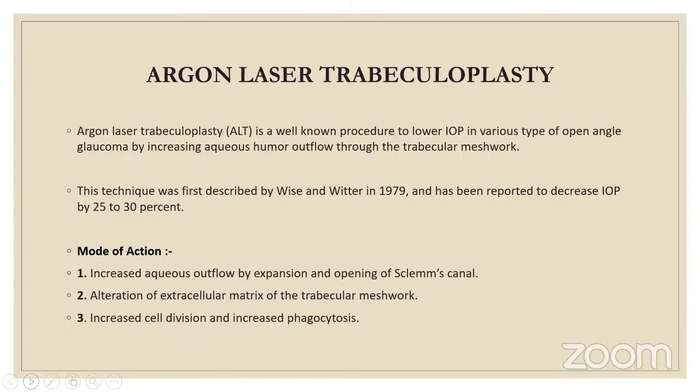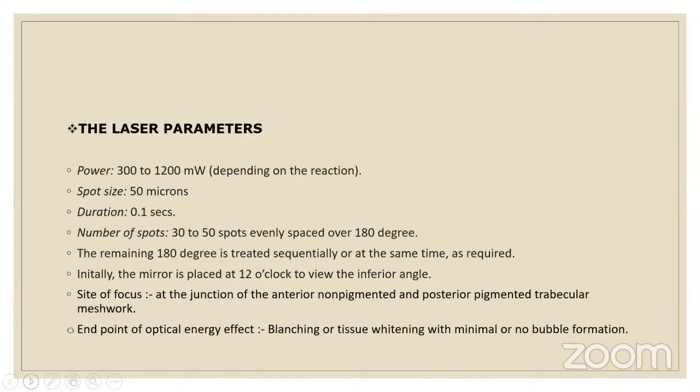to 30%. The mechanism of action is, first, increased aqueous outflow by the expansion and opening of the Schlemm's canal. Second is alteration of the extracellular matrix of the trabecular meshwork, and third is increased cell division and increased phagocytosis. The laser parameter: power is 300 to 1200 milliwatt, depending upon the reaction.